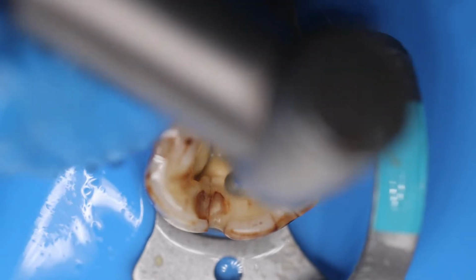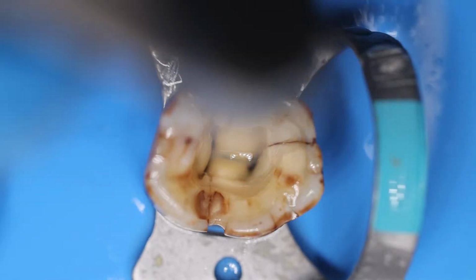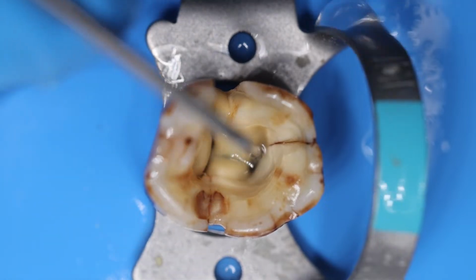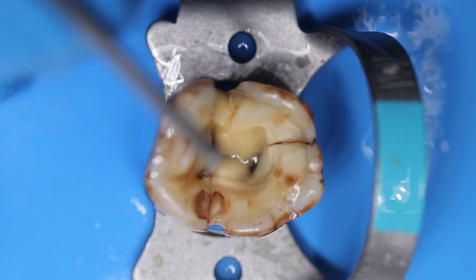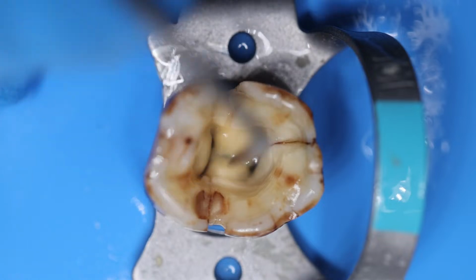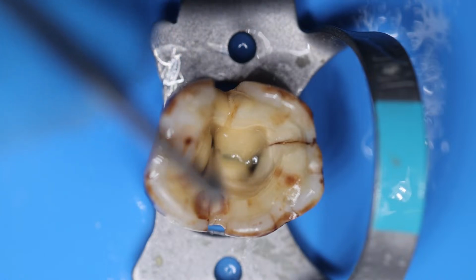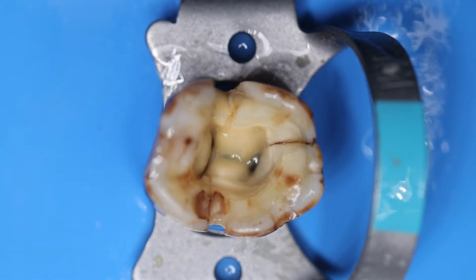So always try that you get a straight visualization of the canal orifices when you observe the tooth from your eyes. Once you can see the canal orifices, that means you can now easily get your files into the canals without any obstruction. If the wall would have been here, then you would have entered like this from the distal aspect. That would not lead to straight line access and you may separate the instrument. So getting a straight line access is a way that you will be free of any instrument separation also.